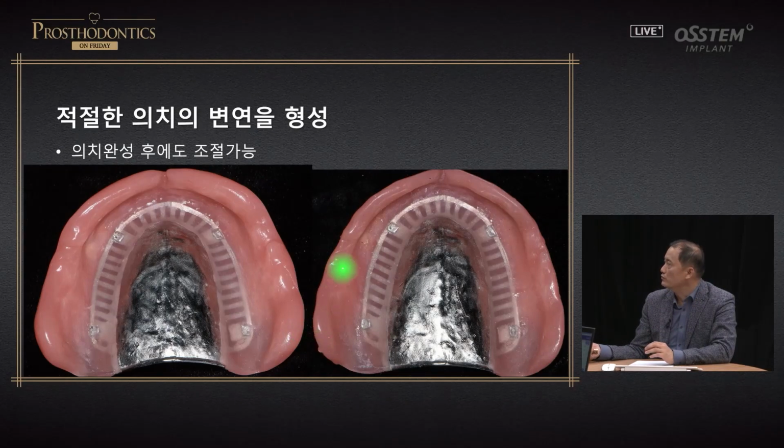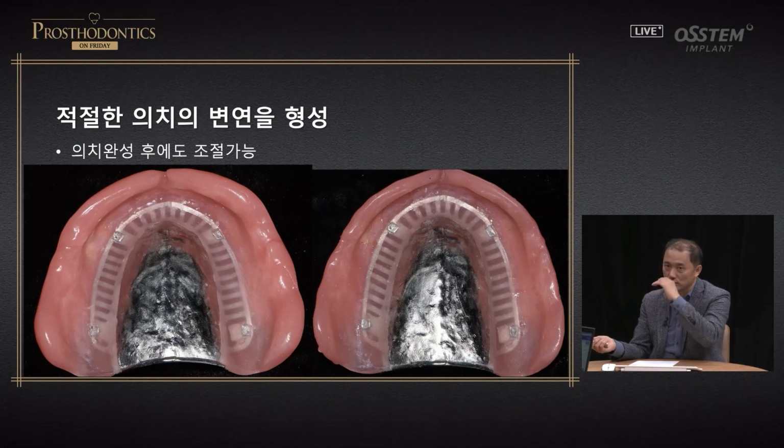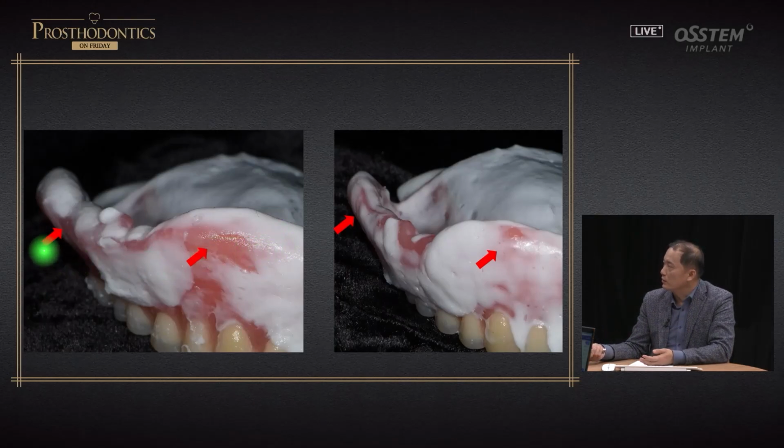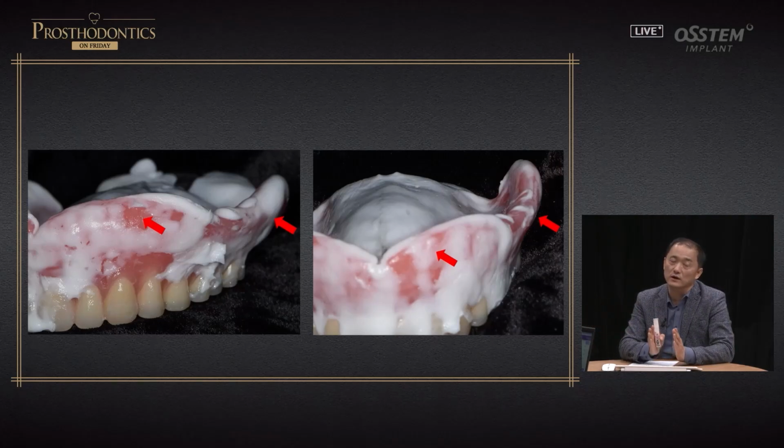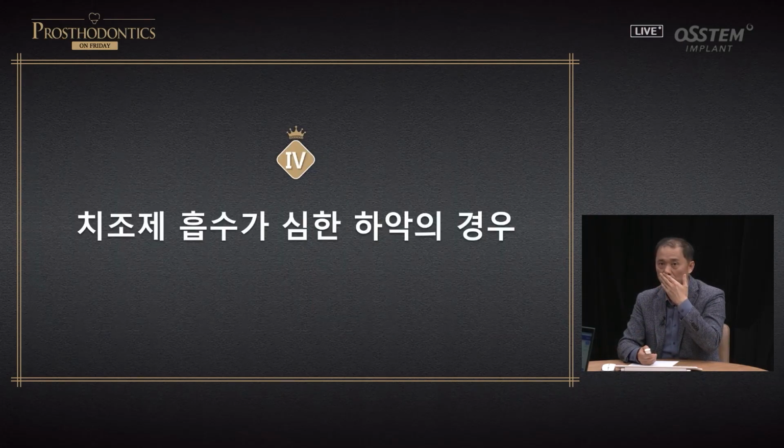Actually, on the left and right side, the dentures are the same. But after finishing the full denture, through a fit checker, we molded it to result in this. And as you can see, we molded this area adequately, and it became more harmonized, and there is adequate sealing. Like this, the excessive area on the labial side is now adequately changed. The upper side was too flat, but with the adjustment it is rounded, and there's a harmonized result. Of course, this resulted in better retention.